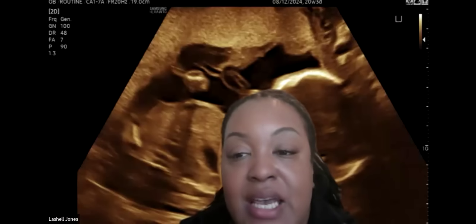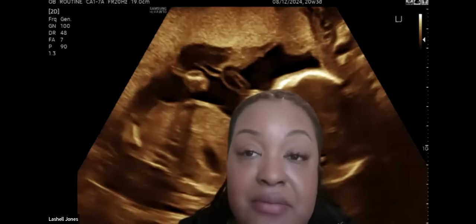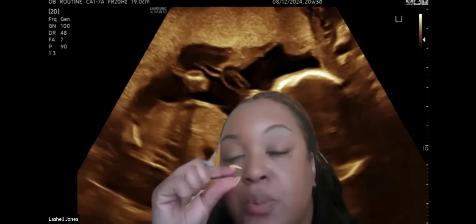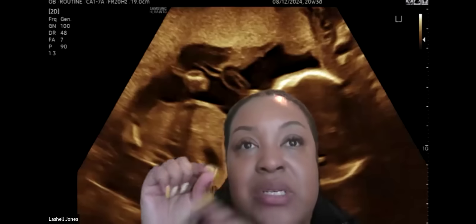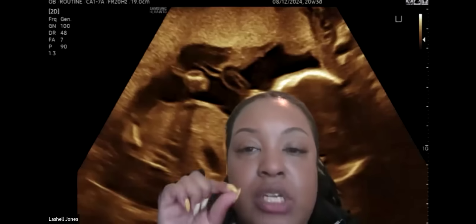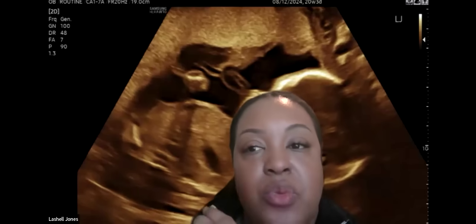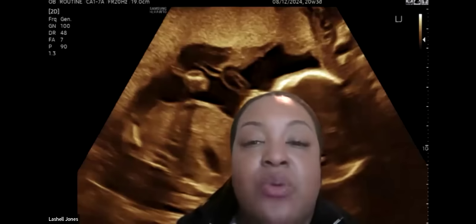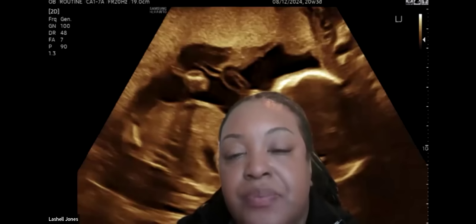She came back for a genetic scan. She did a level 2. She even did a fetal echo, and things ended up being fine. And even as the baby got bigger, the nasal bone, you start to see it was small. It was there, but we couldn't see it because it was so early on, but it was just really small. And of course the nuchal resolved, so it wasn't as thick later on, and baby was fine. But we saw that in those additional ultrasounds that we offered to the patient.